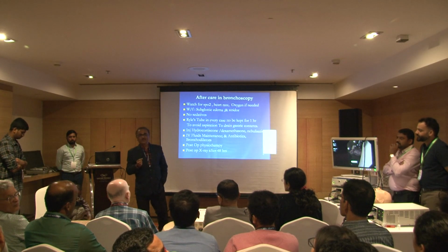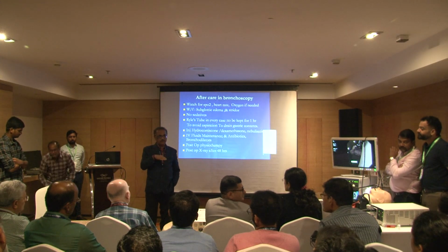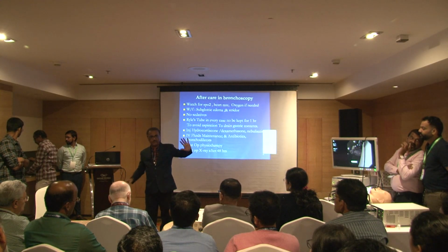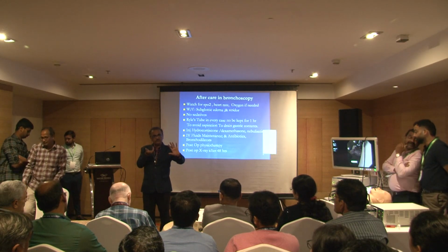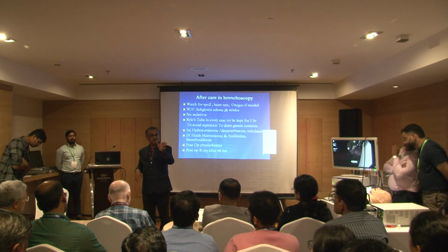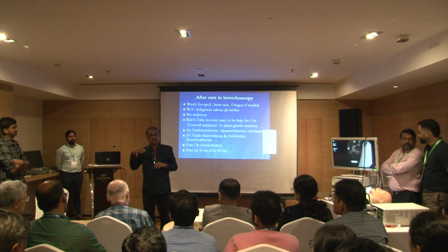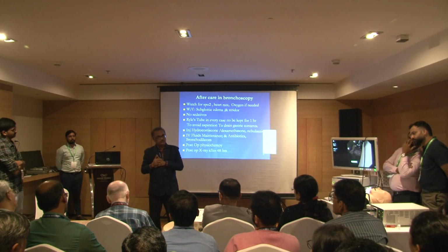Yes. Then if I am at the center of the table and I want to go to the left, I'll shift my chair to the right side of the table, head end. Okay. Then my scope is rotated 180 degrees, so that the axis becomes straight. Then I turn the head of the patient to the right side, so that my axis, all the time I am thinking in mind that my axis should be straight, because I am handling a rigid tube, and that too in a child.